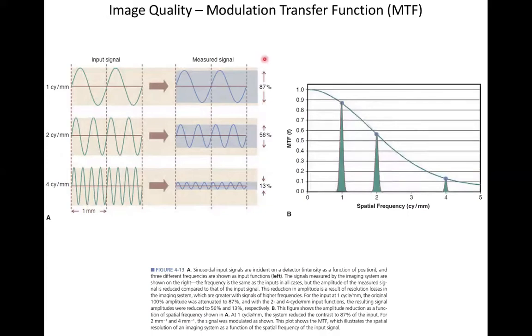and we'd like to mathematically quantify that behavior, we can turn to something called the modulation transfer function. That function characterizes our system completely in terms of the spatial resolution or its ability to resolve things as a function of higher and higher frequencies. We plot as the independent variable here, the spatial resolution or spatial frequency, in this case in cycles per millimeter.